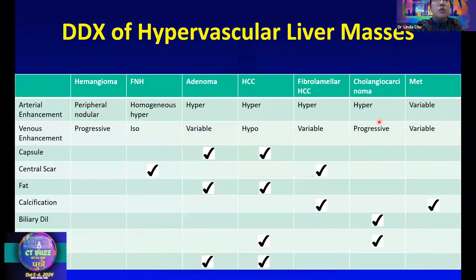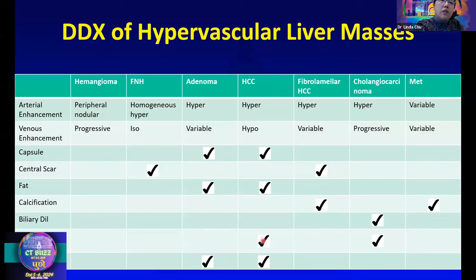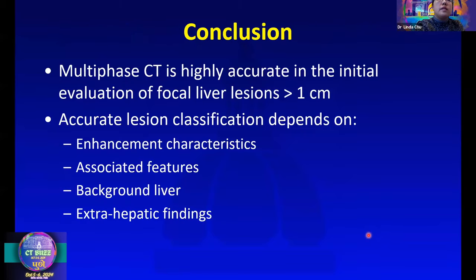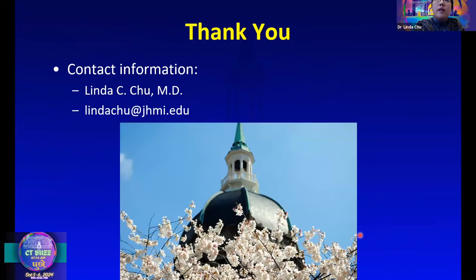In summary, I've reviewed the major imaging findings of hypervascular lesions. Looking at the enhancement pattern on arterial and venous phase is critical. Ancillary features such as capsule, fat, or bleeding narrow the differential to adenoma and HCC. Central scar can be seen in FNH and fibrolamellar HCC. Calcification is most helpful for fibrolamellar HCC and certain metastases. Vascular invasion is seen most commonly with HCC but also with cholangiocarcinoma. Multi-phase CT is highly accurate for focal liver lesions greater than one centimeter, and accurate characterization depends on enhancement characteristics, associated features, background liver, and extrahepatic findings.